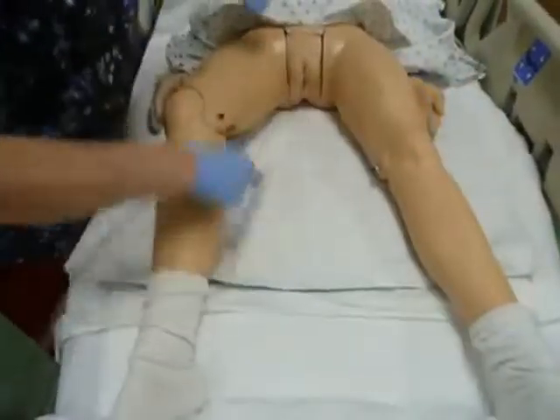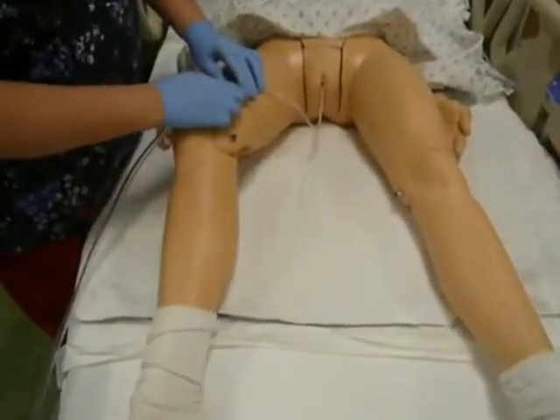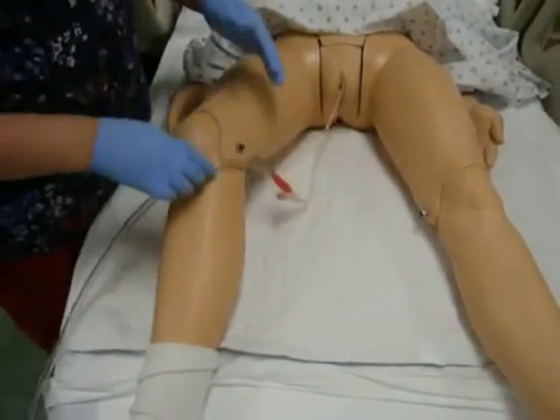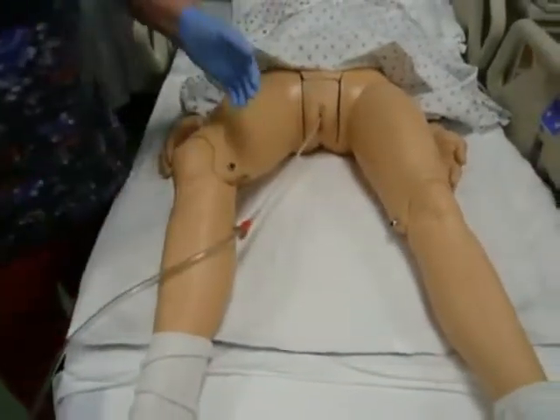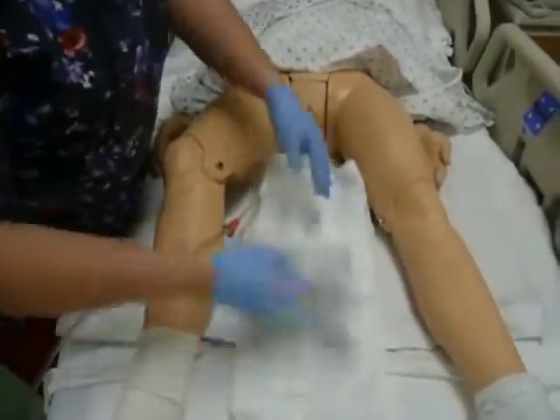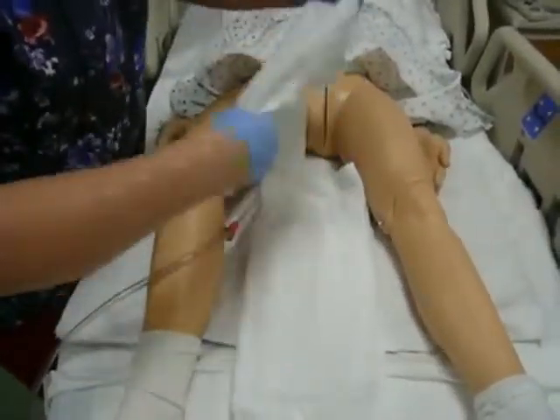I need to make sure my patient can put her legs down. I'm going to secure the catheter some way, shape, or form — piece of tape, cath secure, or something. And before I take off my clean gloves, I'm going to reach back and get the towel and washcloth that I had.